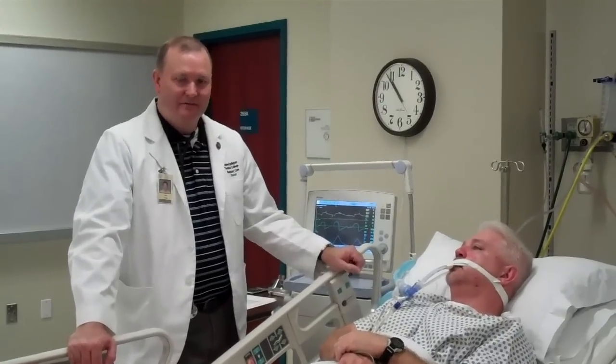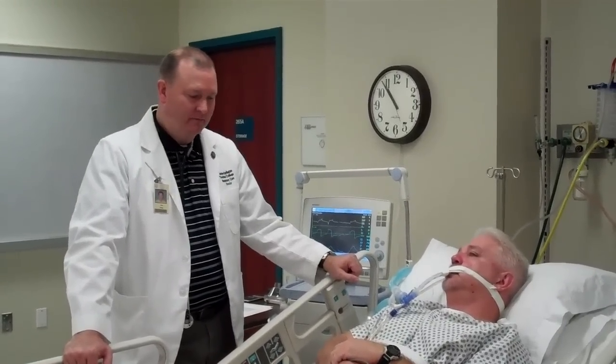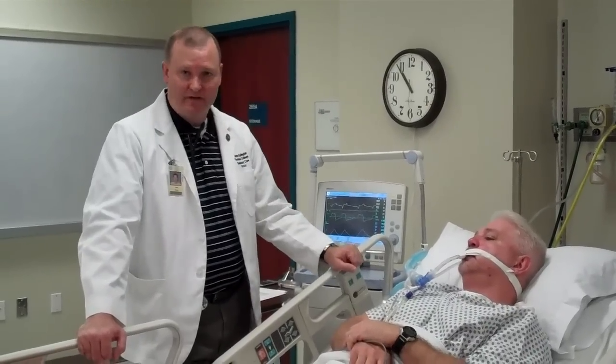All right, we're back again with Mr. Dunphy here, and what we're going to do is demonstrate how to get a negative inspiratory force through the Servo-i ventilator.